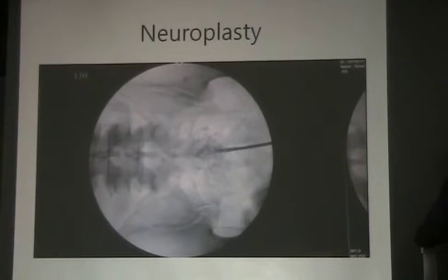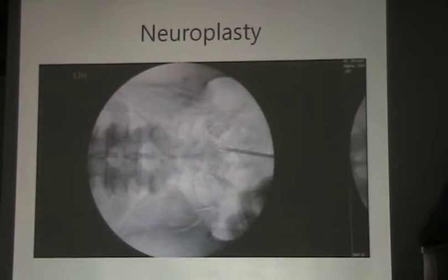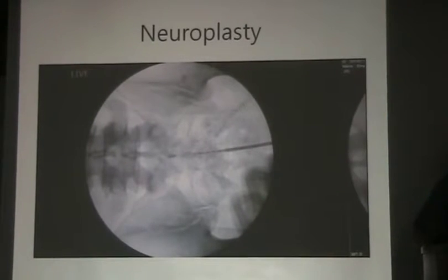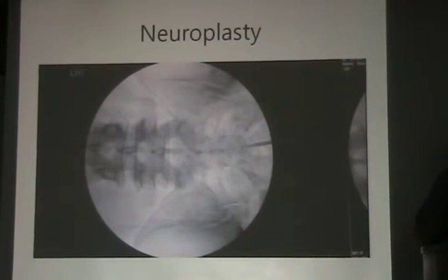To confirm the sacral space and inject the first solution to lubricate the sacral canal, right and left side, and insert the catheter to the sacral space ventrally. The right side first.